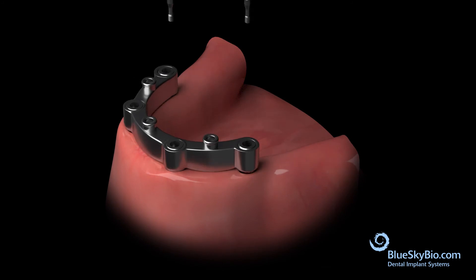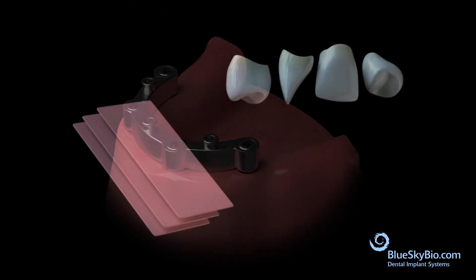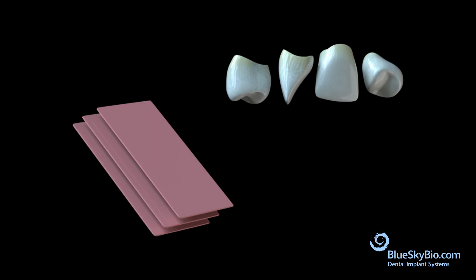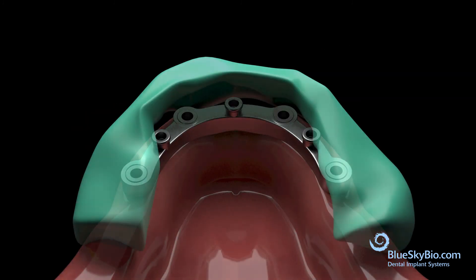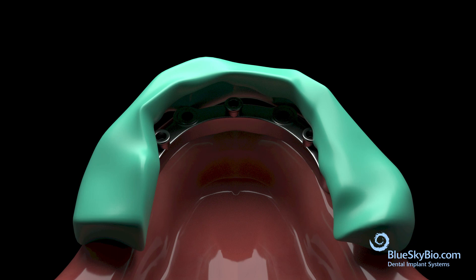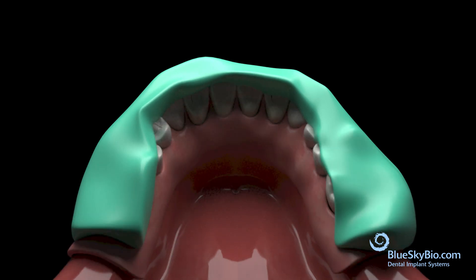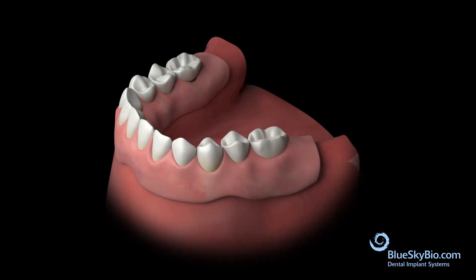Bar is placed in mouth. Wax and denture teeth are used to create a set up on cast. Process the denture and retentive housings as usual. Place the denture in the mouth.